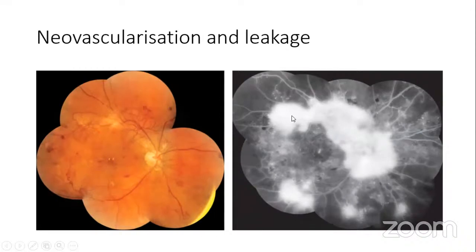Now, what you have here is more than the regular vascular hyperfluorescence. Okay. The simple question I want us to ask ourselves is this: why is it that the vessels that we saw around the disc, we can't really appreciate them so well in this angiogram? The answer is simple. Dye has left the intravascular spaces here.